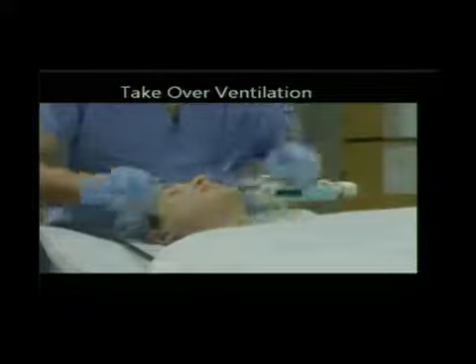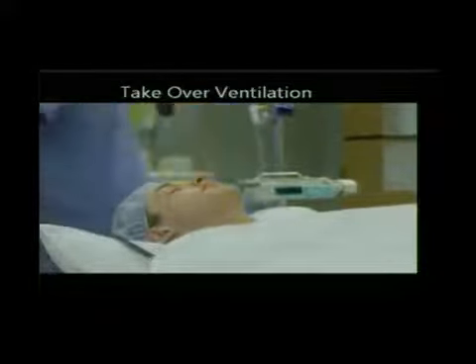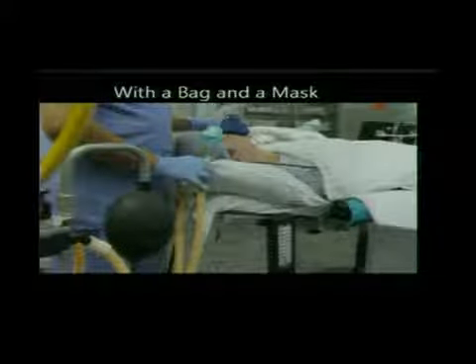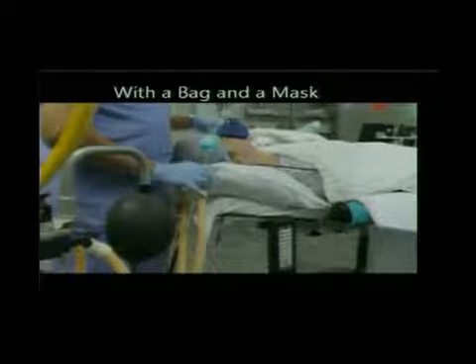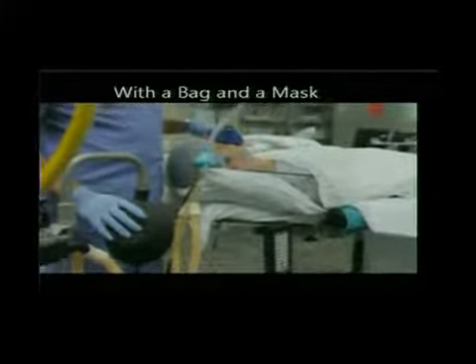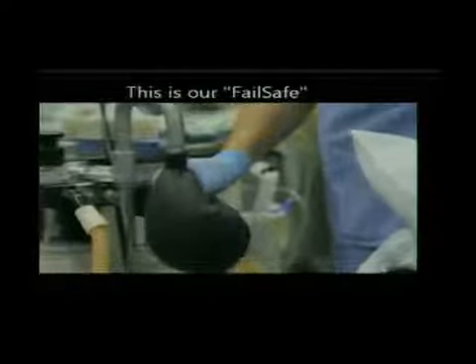So you see no carbon dioxide. He takes off the nasal prongs. Why? He needs to make a seal with the mask, and the tubing interferes with it. So the mask is applied to the face of the patient, the bag is squeezed, and as he squeezes the bag, he forces air into the lungs of the patient.